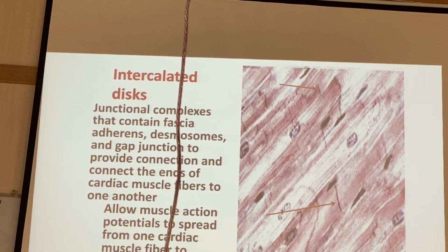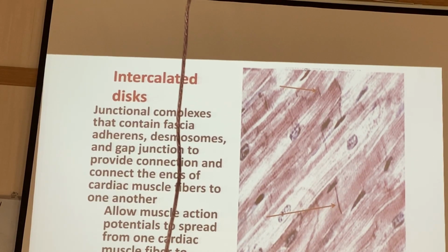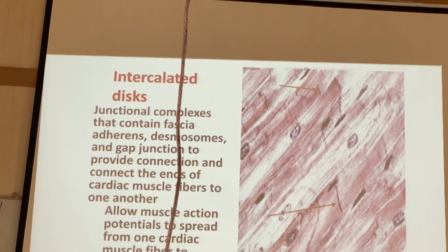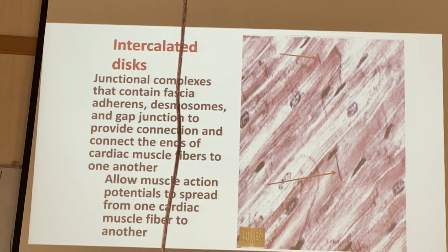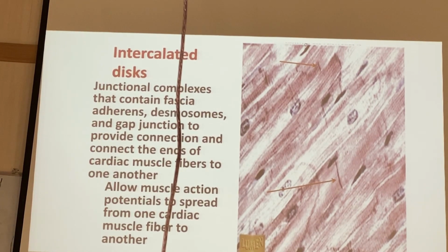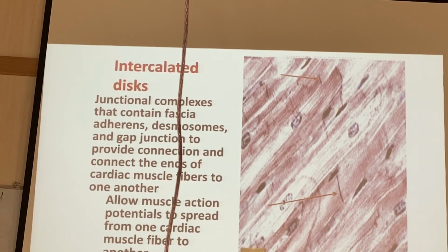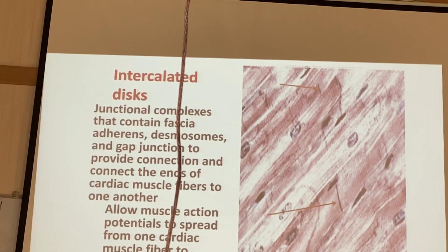Yeah, this is what we have described. Now, my question is, we have 4 basic tissues in the body. Epithelia, they have characteristic features. Muscular, they have their own characteristic features. So on, the connective tissue and the neural tissue. Now, the characteristic features of the epithelia, we are now applying on the muscular tissue.